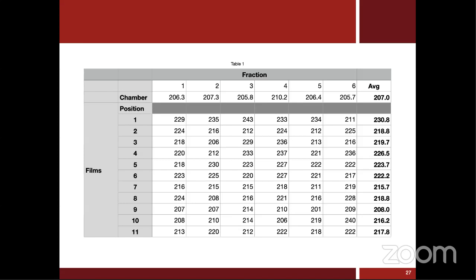The next question is regarding TBI. The questioner asked, they are using films for TBI in vivo dosimetry. So is it advisable to wrap a paper around the film in the case of TBI also? Well, that is a bit tricky. I don't know, for example, when you put this piece of paper, how much the dose is going to be reduced on the other side.